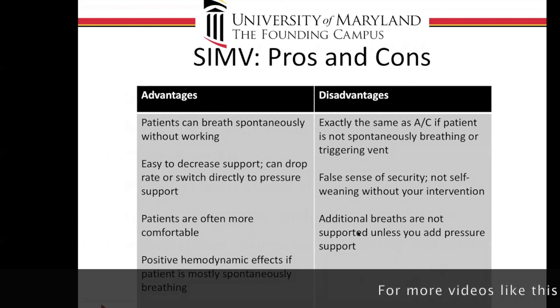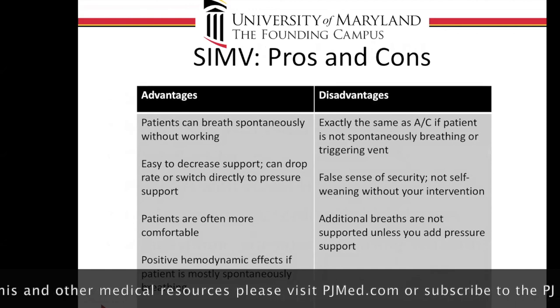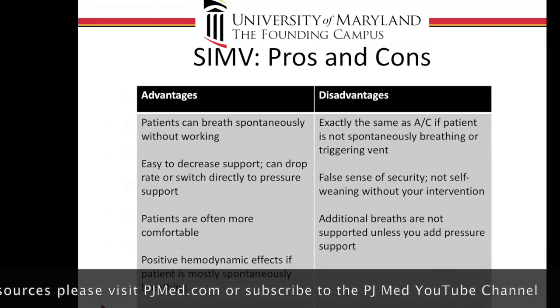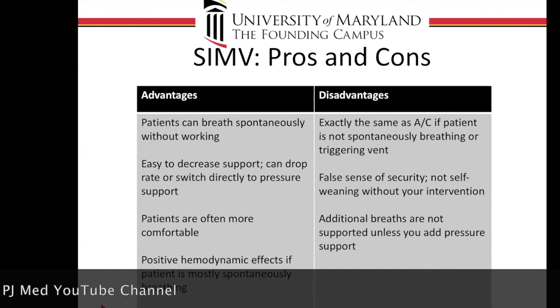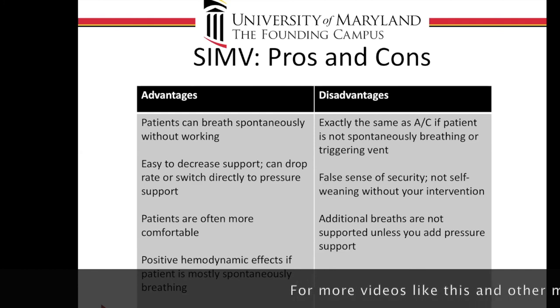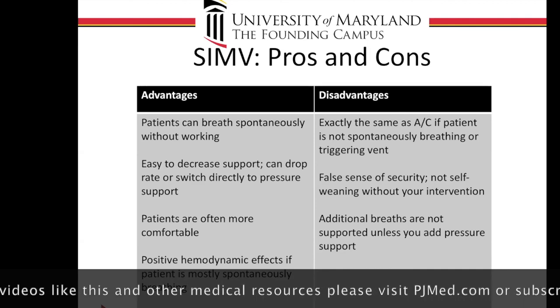But I think the important thing here is, if you've got a really sick patient and you put them on this mode, it's basically going to be exactly like the previous mode I showed you, that continuous mechanical ventilation. Because if they're that sick, they're not going to want to do a lot of spontaneous breathing, and you should be sedating them so they're not trying to do that. And you're giving them a nice, regular, positive pressure ventilation, okay?